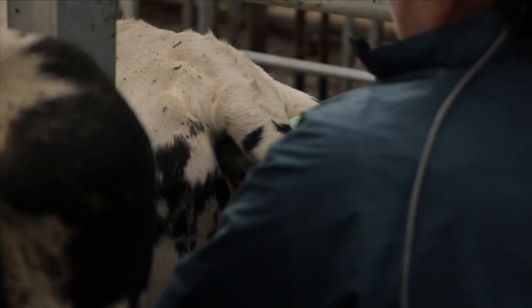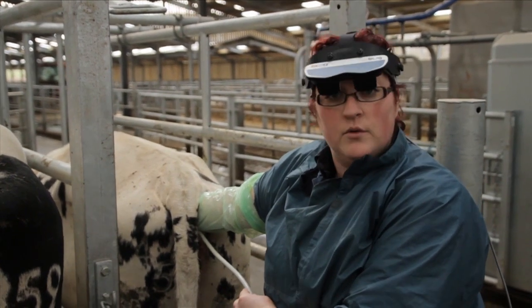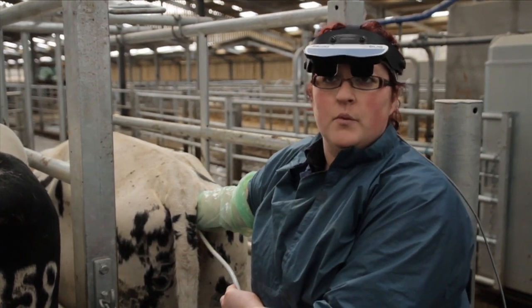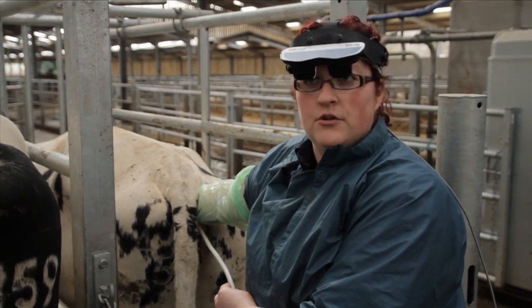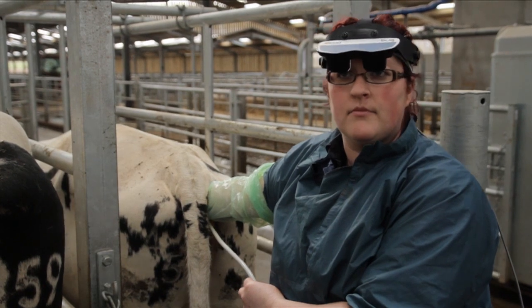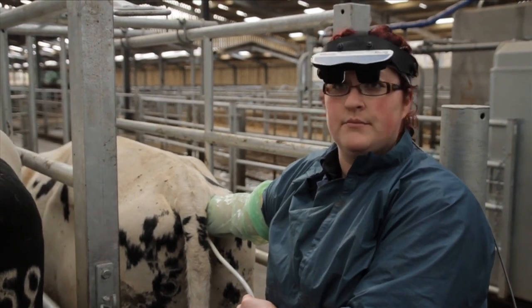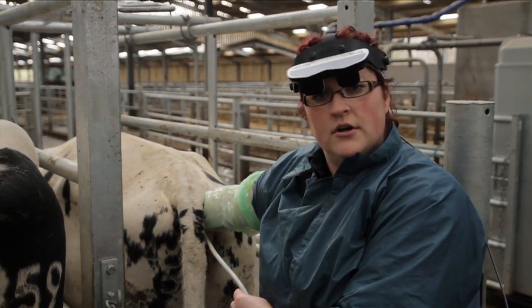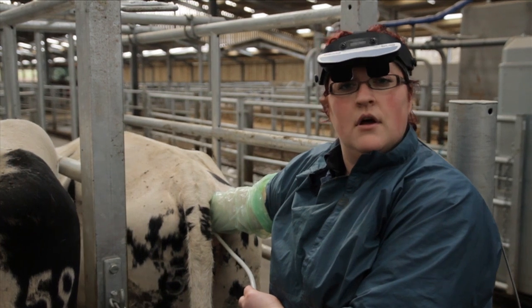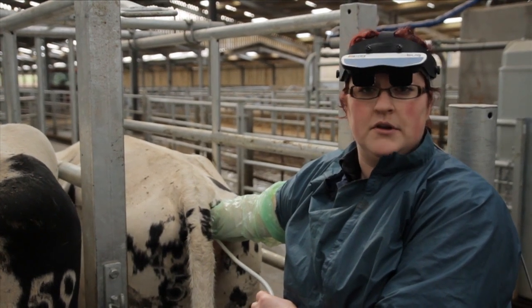We're now inside the cow. We want to perform our examination in a methodical way. So we can start back at the cervix, travel up to the uterine body, then go up one uterine horn to the ovary and back to the uterine body. Then we can go up the other horn, up to the ovary on the other side, and back down to the uterine body.